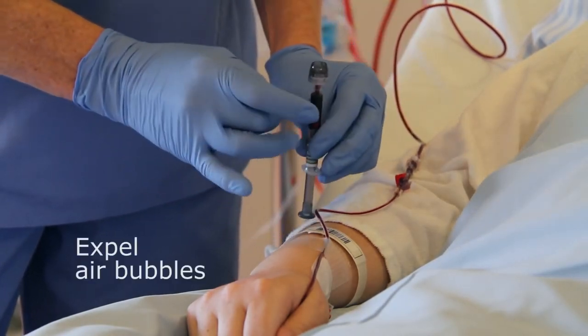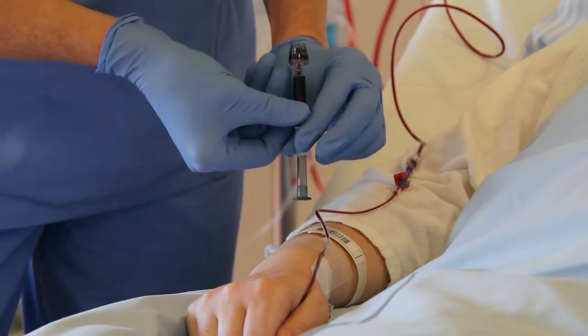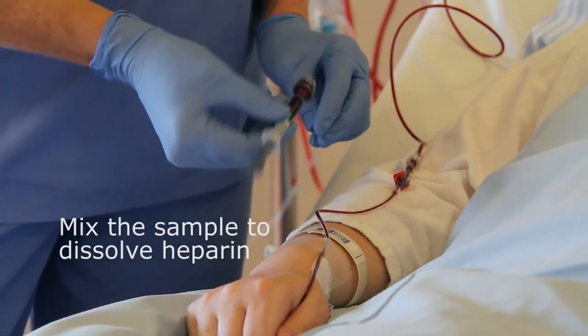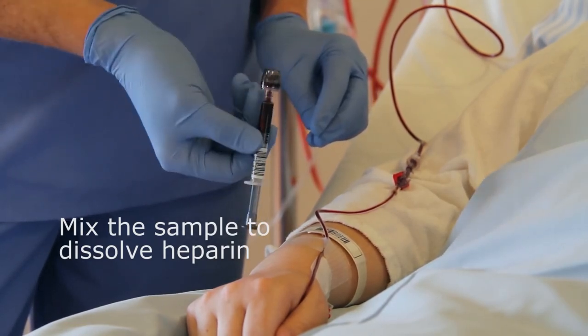Gently tap the syringe so that air bubbles are forced to the top. Expel air bubbles through the tip cap or into a gauze. Mix the sample thoroughly to dissolve the heparin.